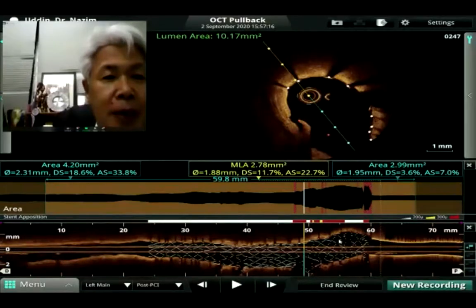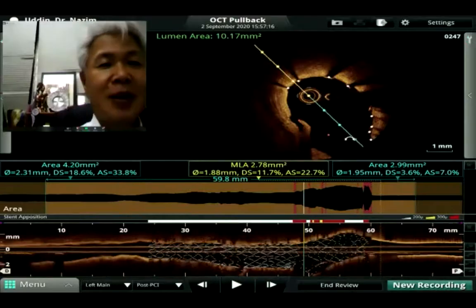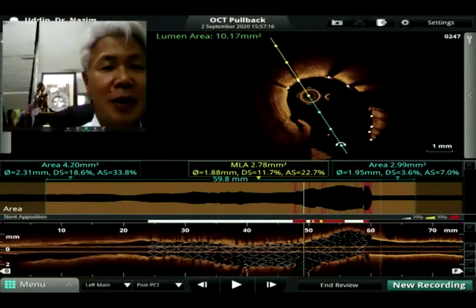Yes. And try to rotate the short axis view. The CX should be, try to check the longitudinal view, right? Can you rotate this? Yes, short axis view. No, the right upper side. So you try to rotate and show the blue color to the CX side. Yes, it should be okay. And you can see the CX at the bottom, right?